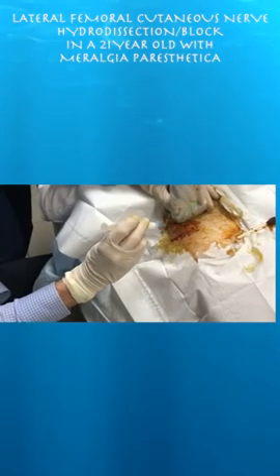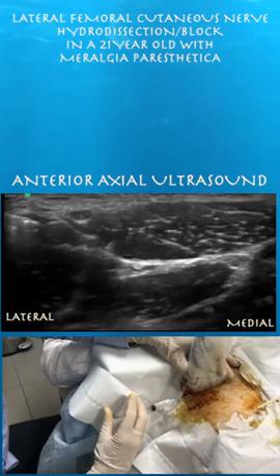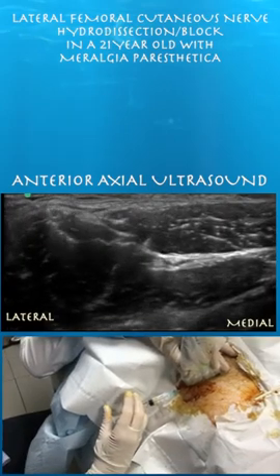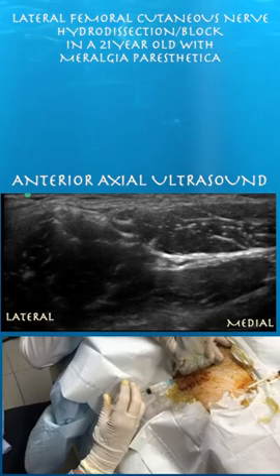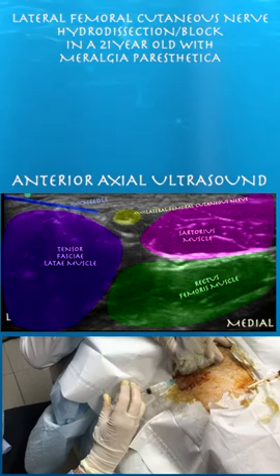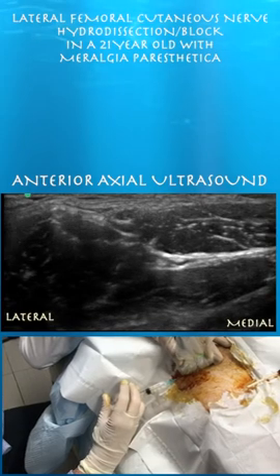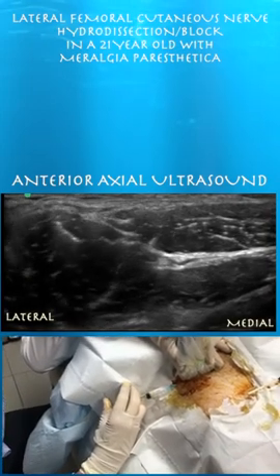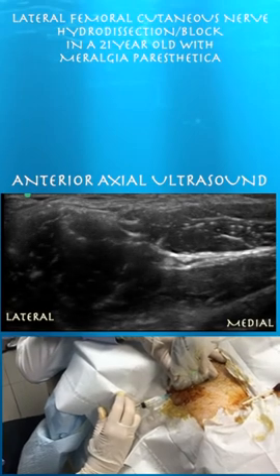Now we're starting the procedure. We're a little too deep actually, so this is a really superficial injection. You want to have the patient at the edge of the table so you can re-angulate your needle if need be. Here we're trying to get the needle just around that perineural fat — that's where our injectate is going to go. We're using a cocktail of saline, lidocaine, and methylprednisolone. You can appreciate some of the muscle layers surrounding the nerve. Just keep your eye on the tip of that needle — you can see how close we are getting to the nerve. We don't want to actually go through the nerve; we just want to get around the nerve and inject fluid around it.